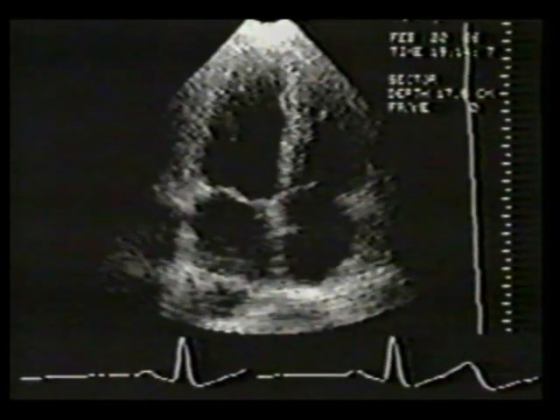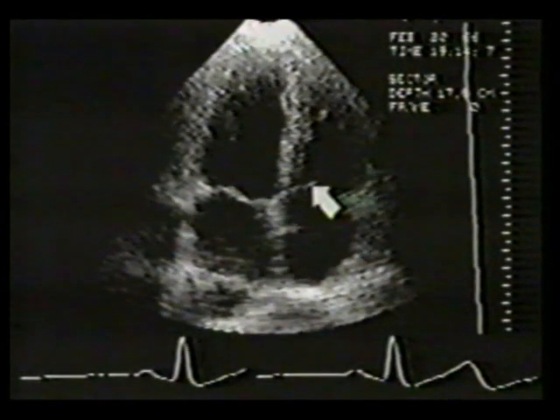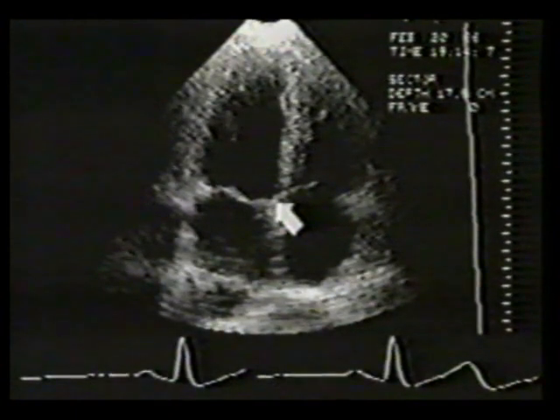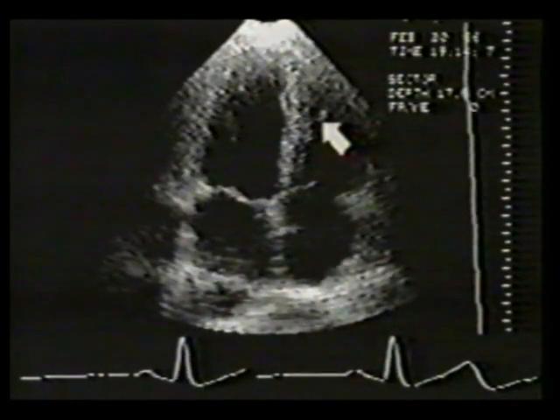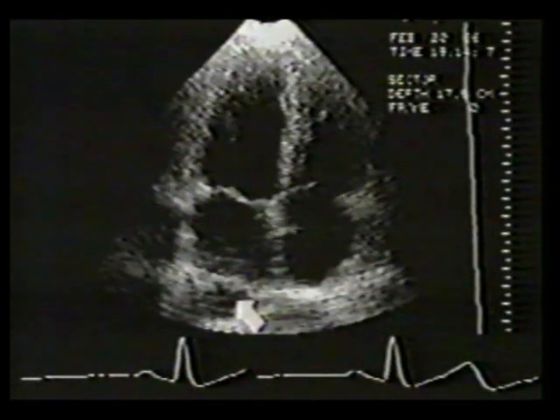In this systolic still frame, the mitral and tricuspid valves are closed. The morphologic right ventricle can be identified by the location of its tricuspid valve. Note that the base of the septal tricuspid leaflet inserts slightly toward the apex, below the insertion point of the anterior mitral leaflet. Another easily identifiable marker for the right ventricle is the moderator band. In this frame, the descending aorta is also apparent behind the left atrium.